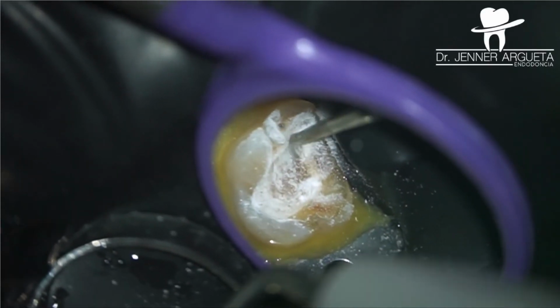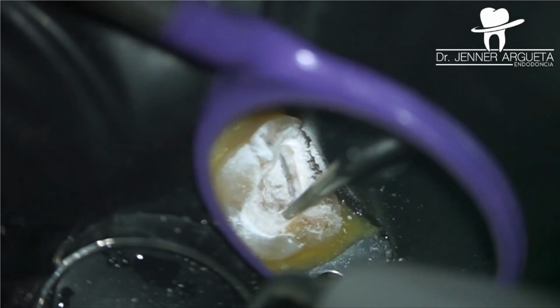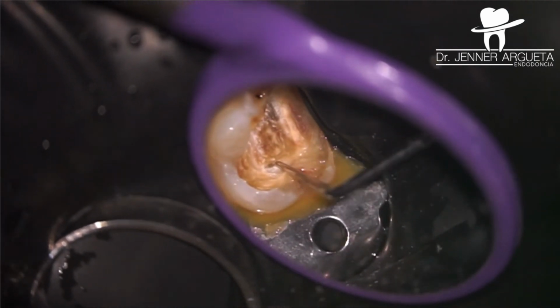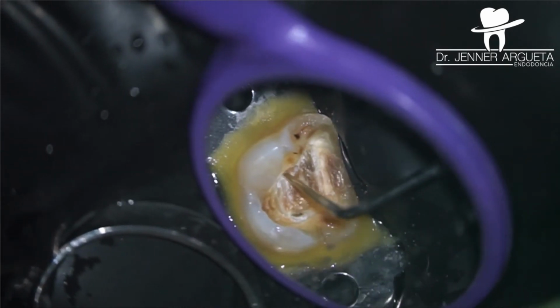So we need to preserve that healthy structure that is remaining on the tooth. So having in mind the anatomy of that upper first molar, we started removing the tertiary dentin that was formed at the pulp chamber, trying to look for the entrances of the root canal system.